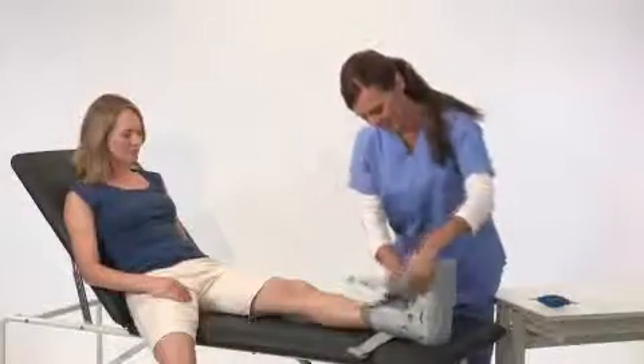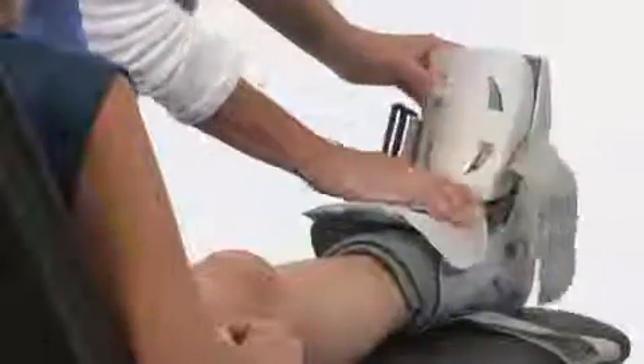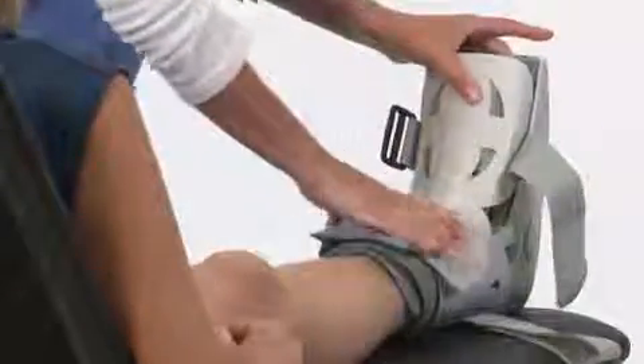Position the front panel so that the Aircast logo is over the toes. Now secure the front panel with the lower part inside the brace and the upper part outside the brace.